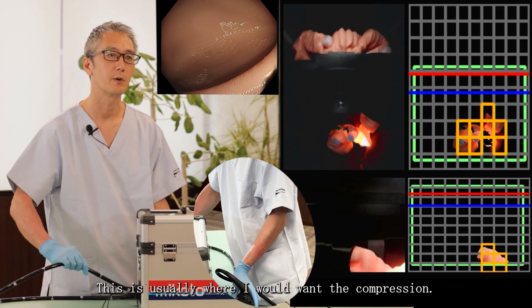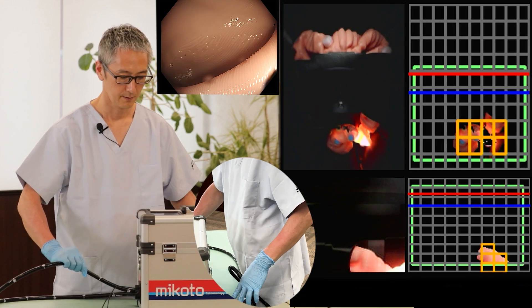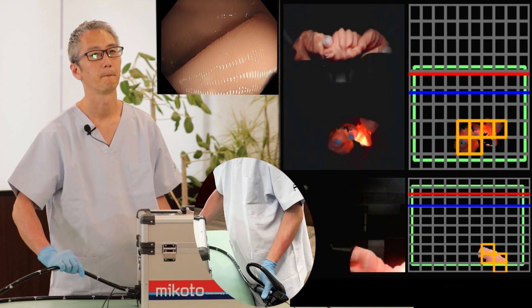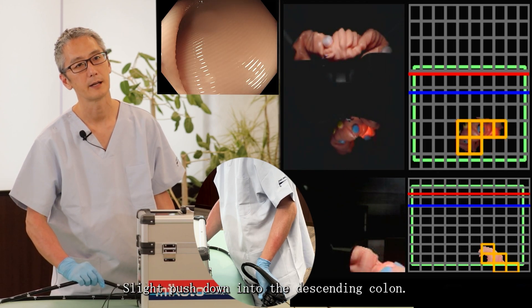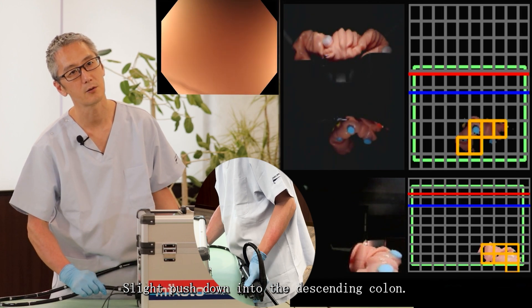This is usually where I would want abdominal compression, so I put the abdominal compression function on. While keeping the lumen opening up to the right side, apply a slight push down into the descending colon.